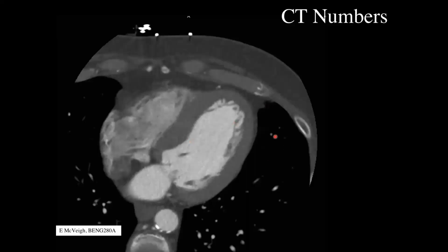So what do the CT numbers look like in an actual image? Here's an image of a patient's chest. This is the blood pool of the heart with contrast in the blood, so it's attenuating more X-rays. It looks brighter. Hounsfield units will be larger. This is myocardium, just like muscle. Chest wall, this is actually fat. This is the skin here, and this is subcutaneous fat, some muscle in the chest, bone, the aorta.